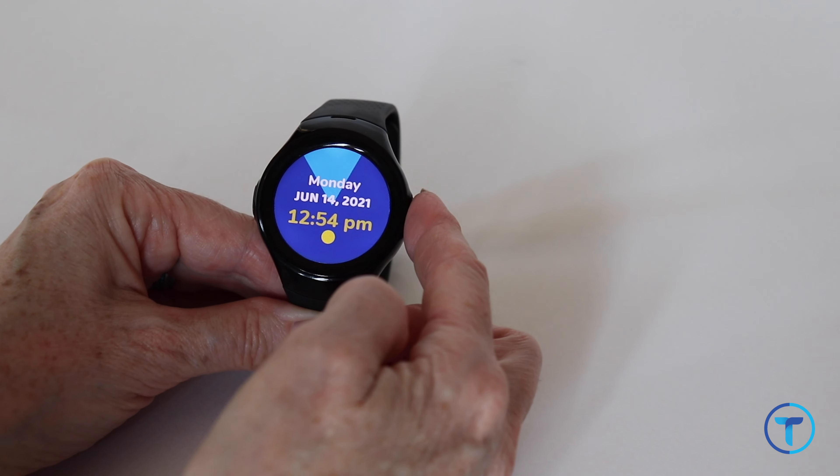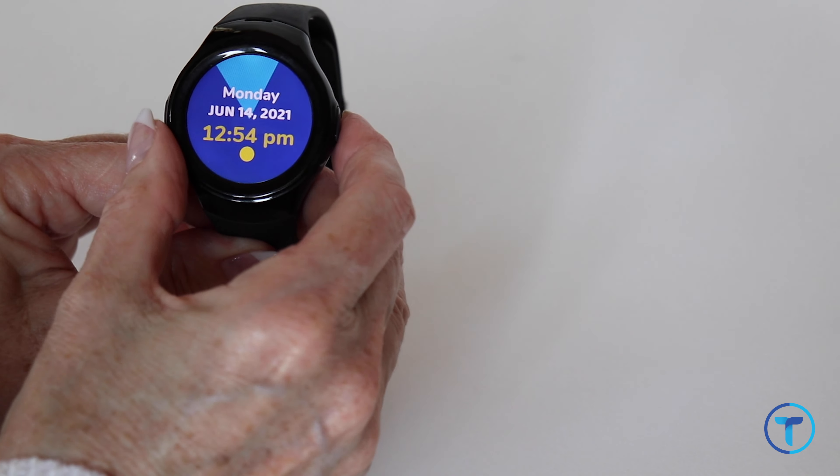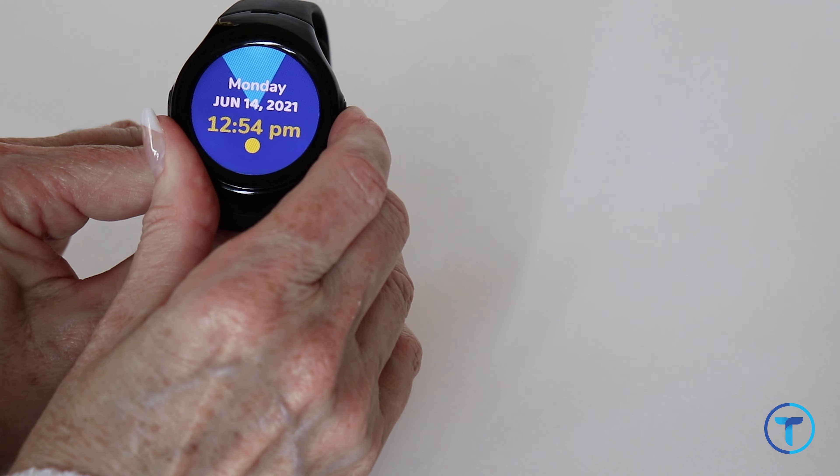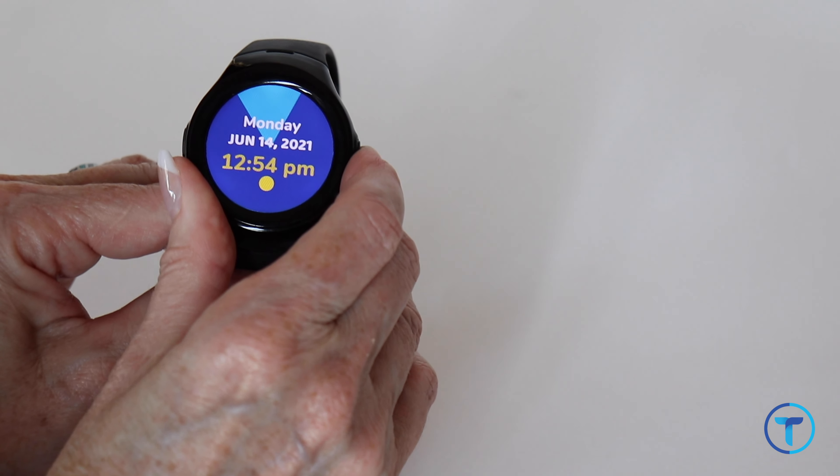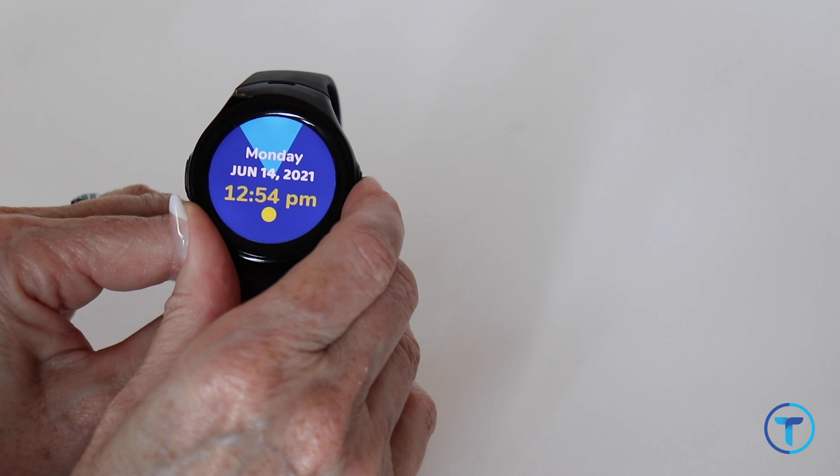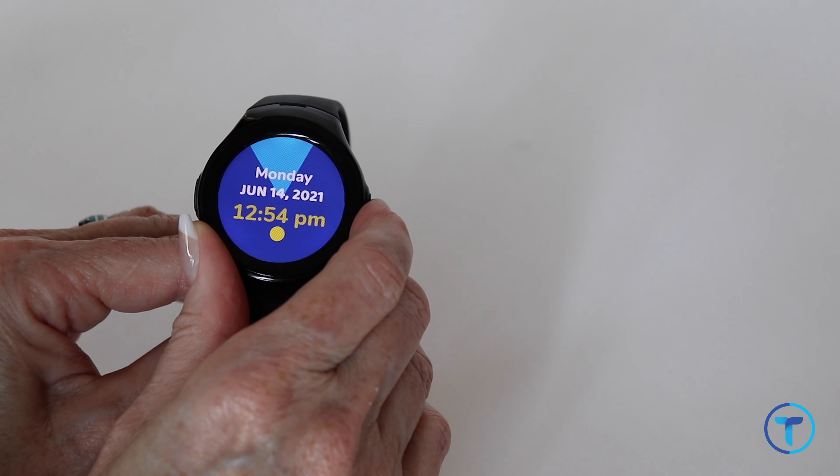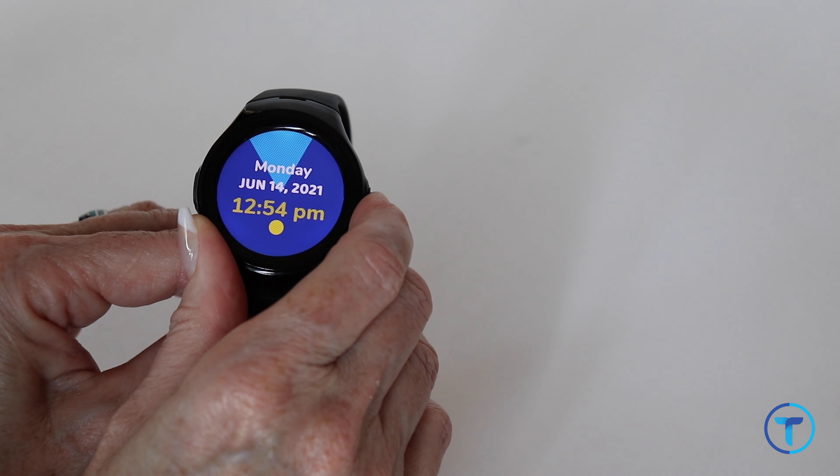However, the on and off button will not allow them to turn the watch completely off. They would have to hold it for a very long time, as we show in this video, and it would automatically reboot and turn back on.